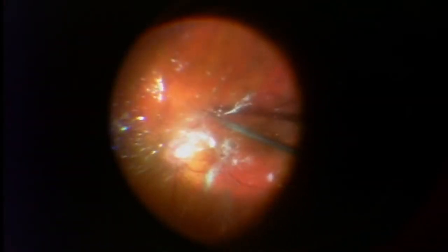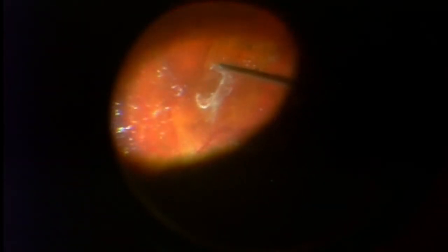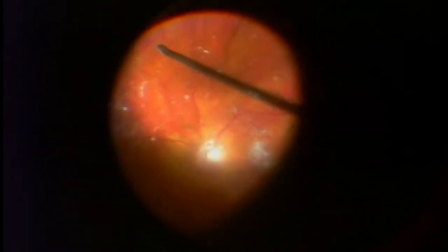In this way, I can most efficiently remove vitreous. What I'm doing here is trying to separate the vitreous from the retina all the way to the sides or to the equator. Now the vitreous can freely move to the vitrectomy instrument — it doesn't really matter where the tip of the instrument is. The vitreous will just flow to the tip of the instrument and it's safely removed from the eye. In this way, I don't need to worry about where floaters or vitreous may remain in proximity to the surface of the retina.